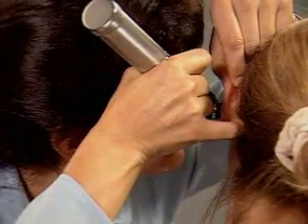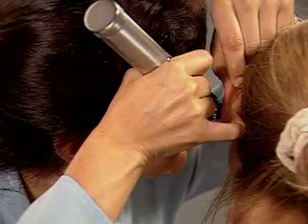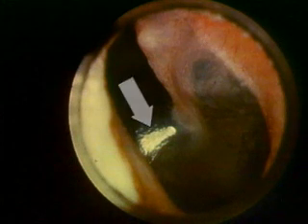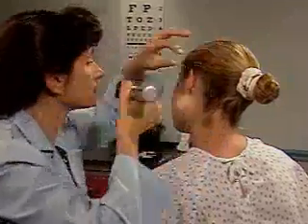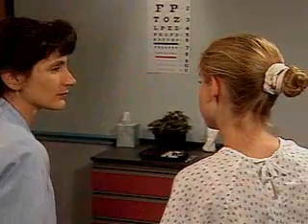Slide the speculum slightly down and forward, and maneuver it until you can see as much of the eardrum as possible, including the pars flaccida if possible, and the margins of the pars tensa. Note the color and contour of the eardrum with its distinct cone of light. Normally, the drum is pearly gray. Also note the position of the handle of the malleus and inspect the short process of the malleus. The handle of the malleus, with the umbo at its tip, crosses the drum obliquely from the cone of light upward toward the short process. Be sure to examine the other ear in the same manner.